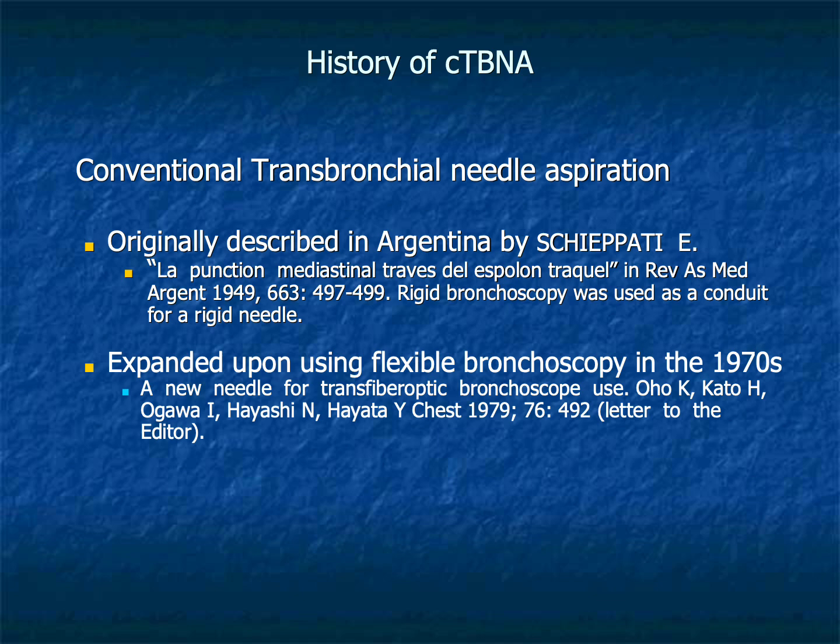Today, despite the widespread availability of endobronchial ultrasound, also known as EBUS, conventional TBNA continues to play an important role in appropriately selected patients and wherever EBUS is not available.